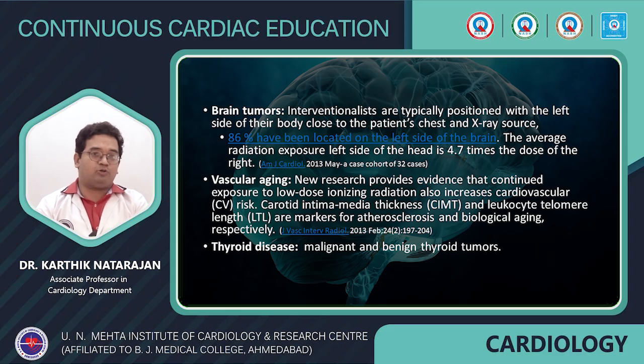Also, it's very important to wear the thyroid shield because we have seen doctors being careless, not wearing the thyroid shield, but thyroid is something which is very sensitive to radiation, and even after 20 years you can have thyroid tumors or thyroid cancers, both malignant as well as benign.